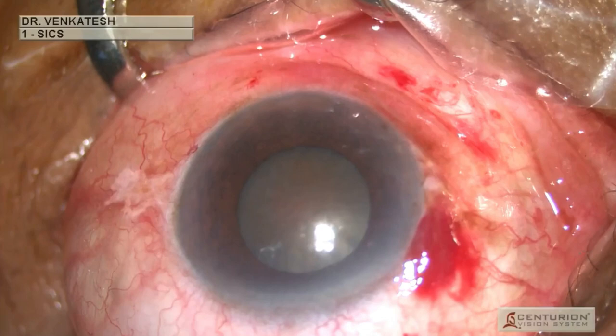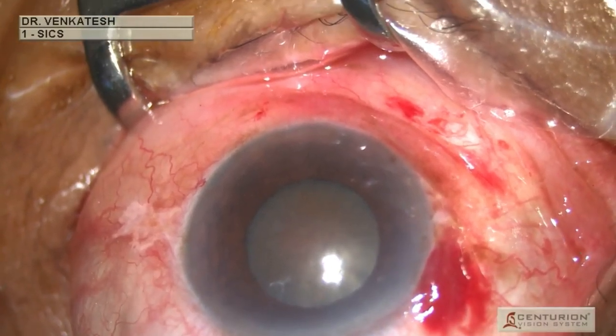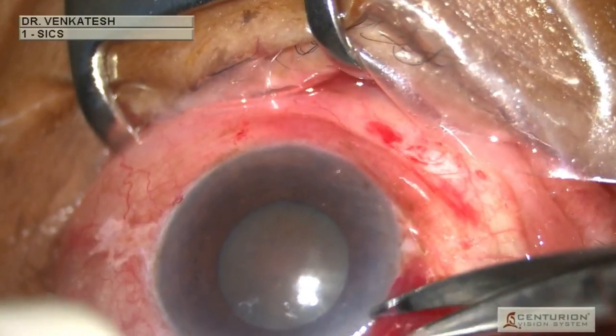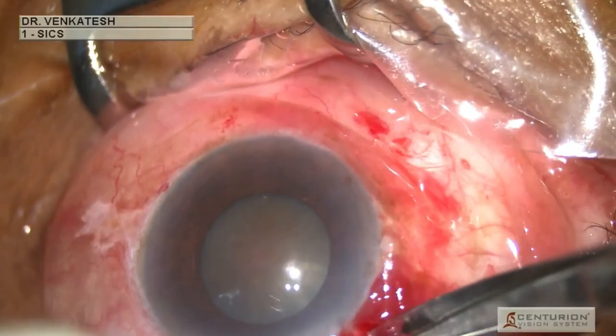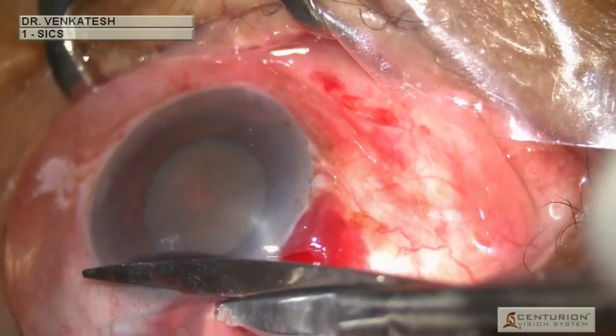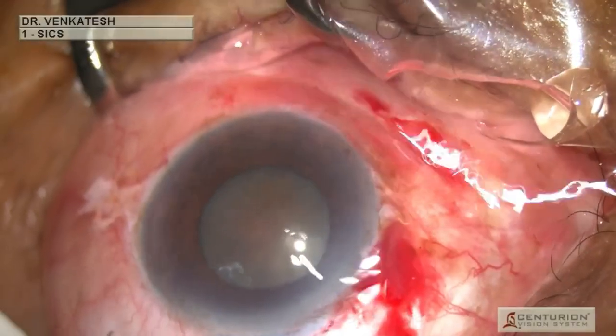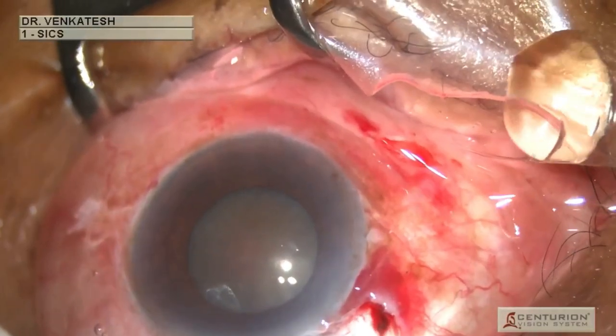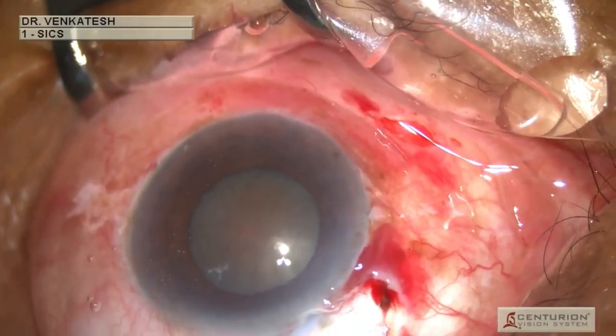A superior approach is performed since the patient had with-the-rule astigmatism of two diopters. Initially the conjunctival peritomy is done, and a bipolar cautery is used to cauterize the bleeding scleral vessels in order to provide good scleral visualization.